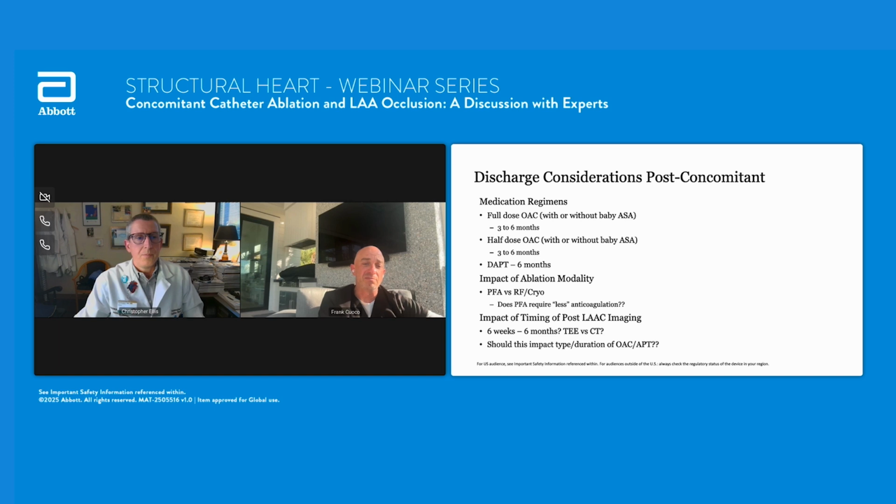And then what about imaging? Should the imaging impact that? Are you going to do imaging at 6 weeks, and if everything looks good, do we stop that and just go to aspirin, or do we keep it another 3 months? As you know, the Simplify trial is going on, and we're looking at regimens in the Watchman population: aspirin only, or aspirin and Plavix, or just half dose OAC. So will the timing of imaging impact your discharge medications as well? I think all those are considerations, and they're all to be determined, and we're hoping to figure that out.